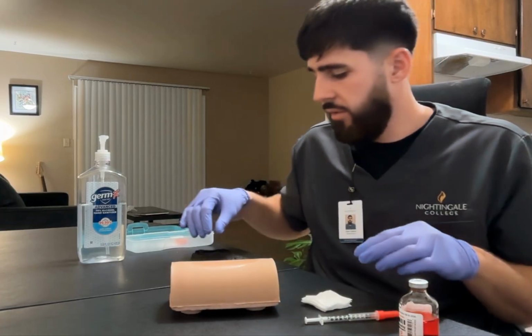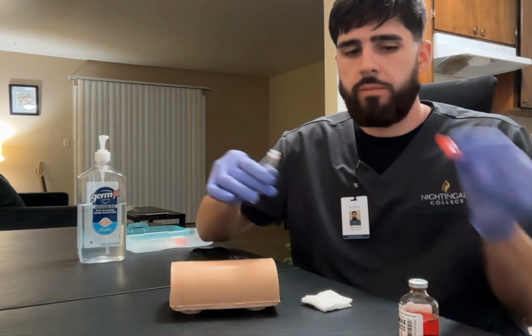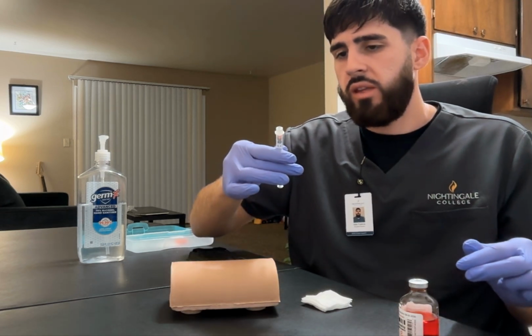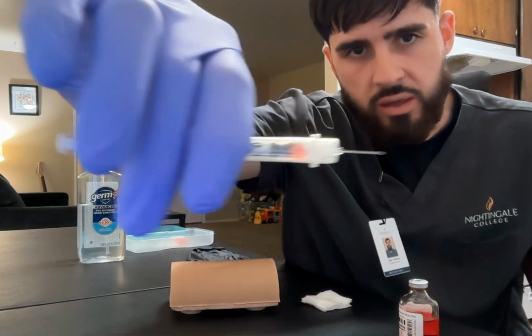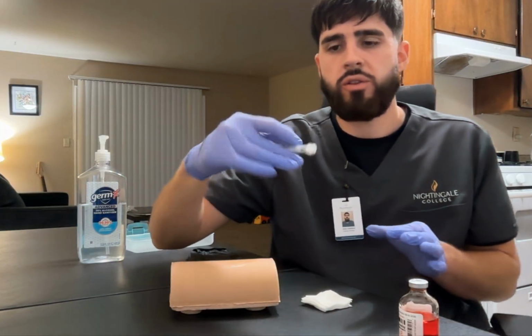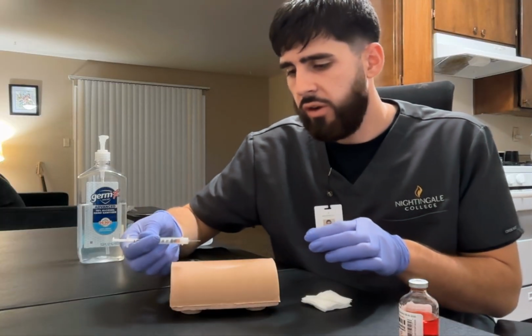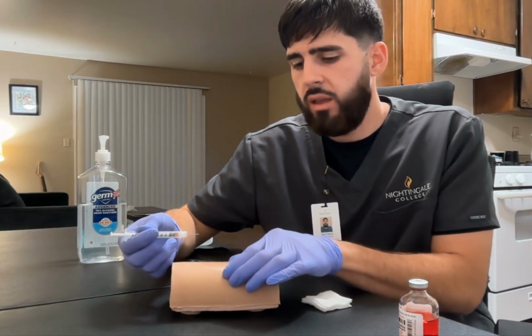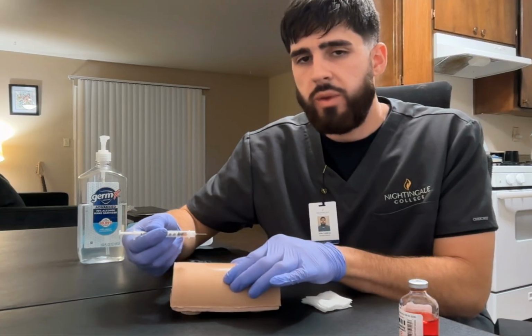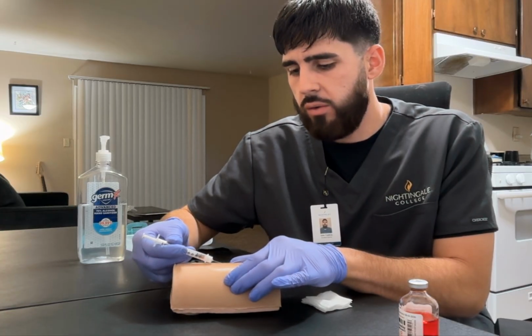For the sake of the time of the video, I'm going to go ahead and grab my syringe, uncap it. Now the bevel needs to be pointed upwards on the syringe, like such, when I am injecting. With my dominant hand, I'm going to hold the syringe like a pencil. I'm going to make sure the bevel is pointed upwards. I'm going to tighten the skin with my non-dominant hand and inject at a 5 to 15 degree angle, about 3 millimeters deep.